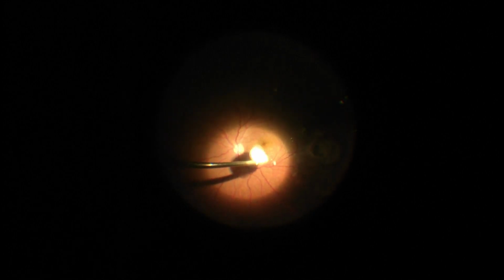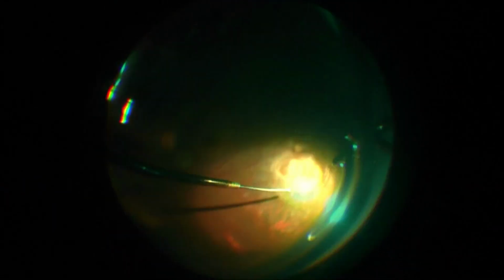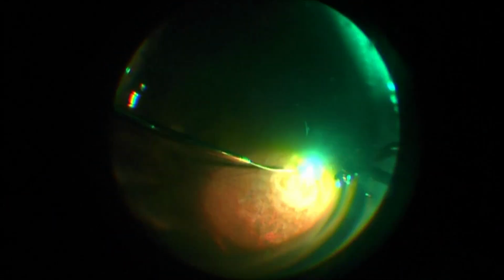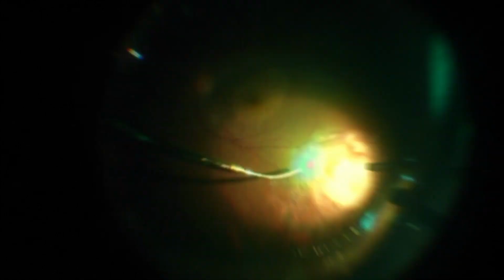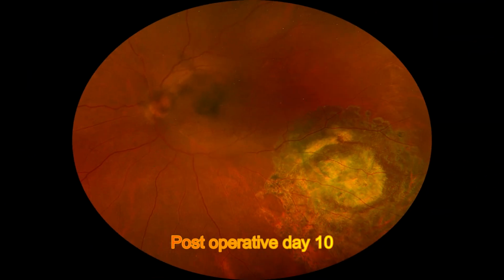High vacuum was used in the vitreous cutter to quickly extract the dead fibrotic cyst. Following fluid air exchange, laser was performed around the area from which the cyst was extruded. On postoperative day 10, the retina was well attached with scarring beyond the inferotemporal arcade.